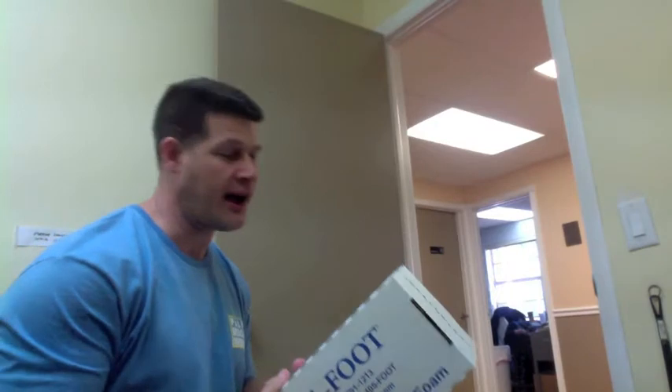I'm going to make a video showing you how to make the proper impressions so that you can do it and we can send it without any issues. I have helping me today Dr. Mallon, the famous Dr. Mallon, and we are going to make impressions using the same foam box which you should already have.